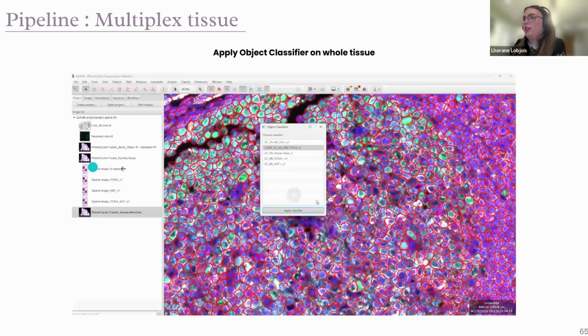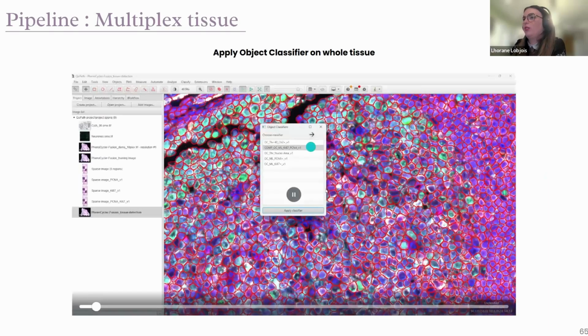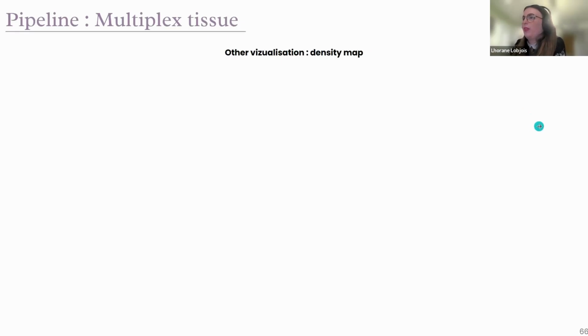And yeah, no, it's not there. Okay, maybe after. You can also visualize the table of that. So you have the table results. If you go on annotation, you will have the germinal center and the tissue, one per line. If you go on detection, you will have one line per cell. So sometimes the PC doesn't like to open it, but most of the time it's okay. Depends on your image, of course.